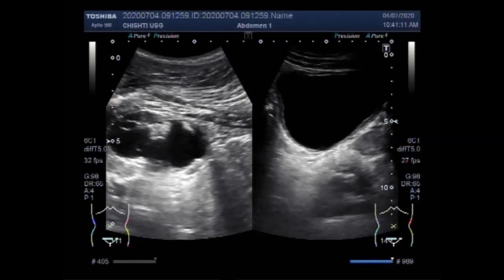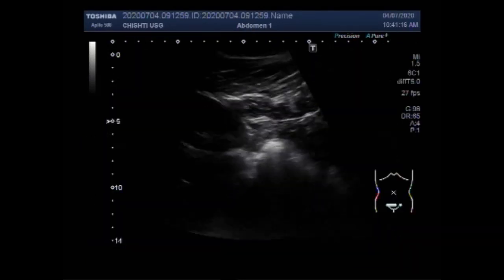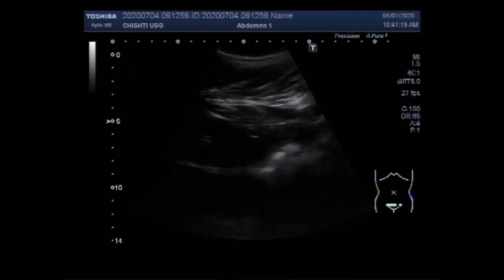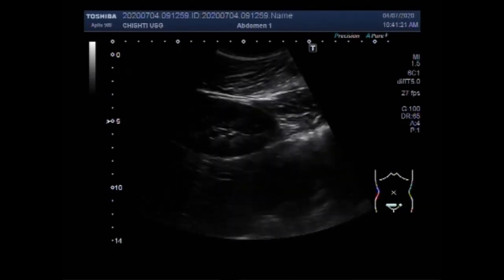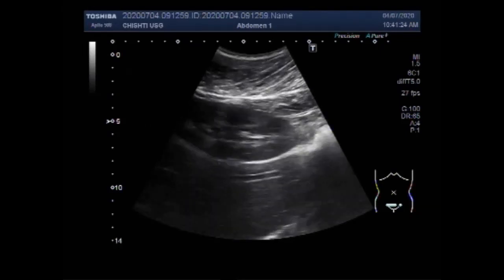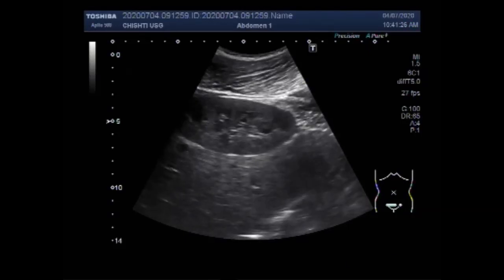Dear viewers, I hope you are all fine. This ultrasound video shows a trabeculated urinary bladder with ureteric stenosis or ureteric stricture at the ureterovesical junction and loss of renal function on the affected side.